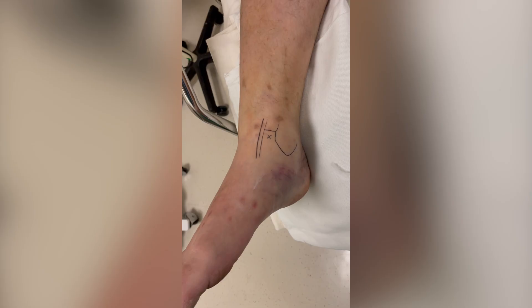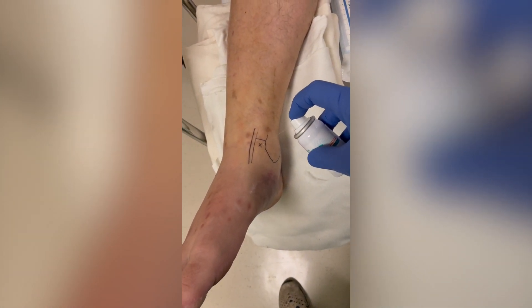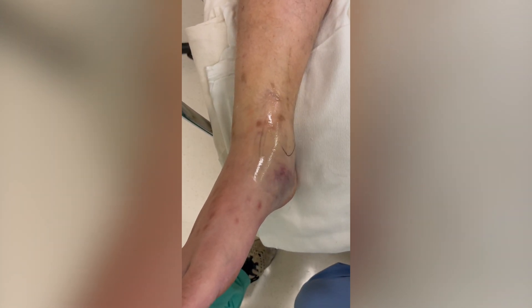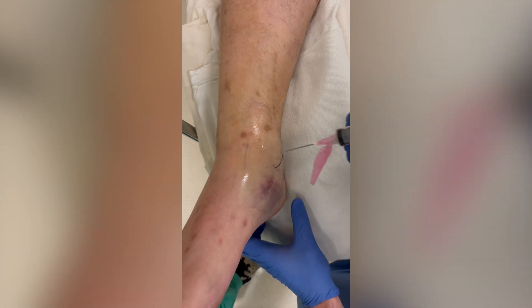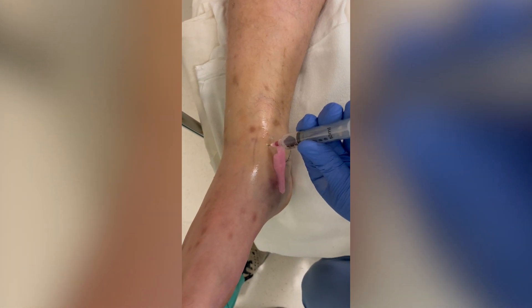Here we will demonstrate a video of our hematoma block. Demonstrated is the supine positioning with the ankle in plantar flexion and slight external rotation. The tibialis anterior tendon and medial malleolus are marked out, and the soft spot between them is palpated and marked. The anteromedial portal is sprayed for anesthesia and then sterilely prepped with chloroprep sticks. Following sterile preparation, the trajectory of the needle into the ankle joint from the anteromedial portal is planned. It should be in a slight lateral trajectory to enter the ankle joint, and you should feel the two losses of resistance as described previously — at the skin and at the ankle joint.